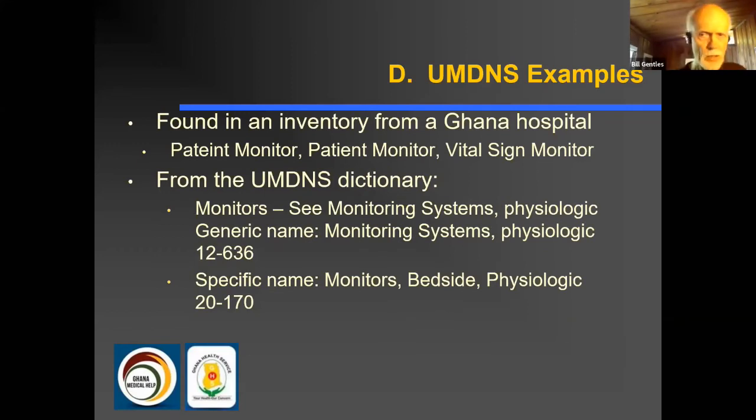And another example from a Ghana hospital, patient monitors are commonly found in many hospitals, and they're often referred to with different names. Here we have the first. Can you spot the difference between the first and the second one? There's a spelling error in the first one.